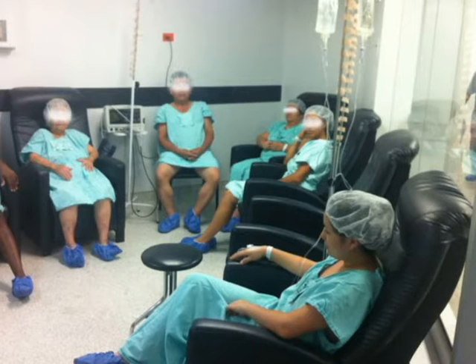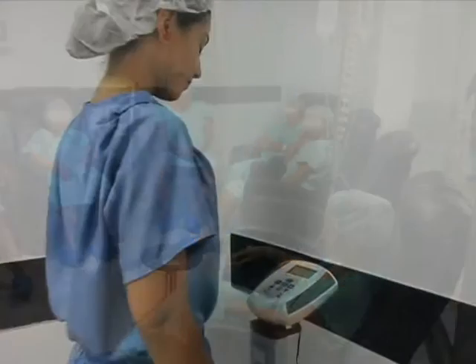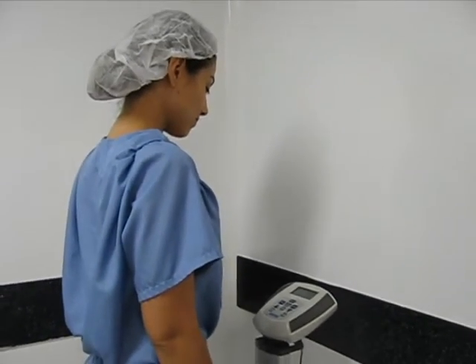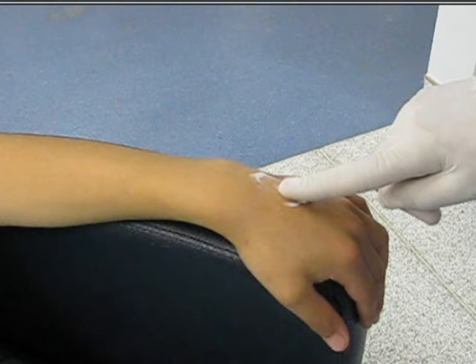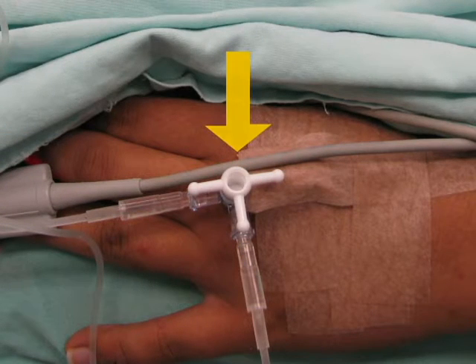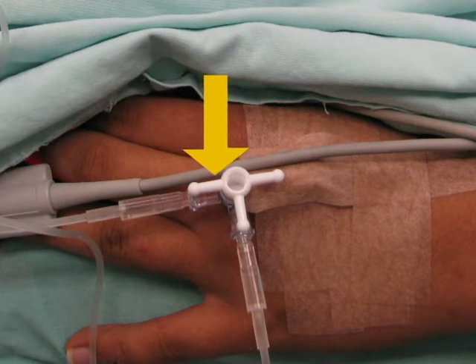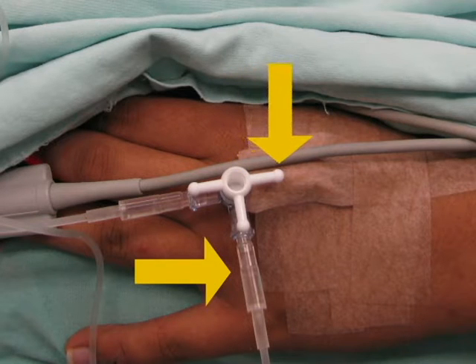The patient enters a preoperative room where the corresponding information is collected, such as height, weight, age, and gender. The peripheral vein is channeled and a three-way valve is connected to the catheter. Through one port of the three-way valve the fluids are connected, and the remifentanyl infusion to another port.